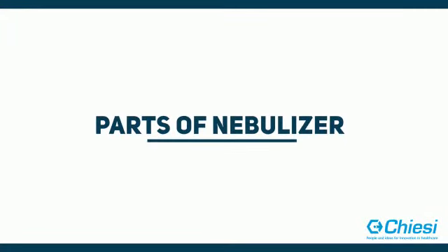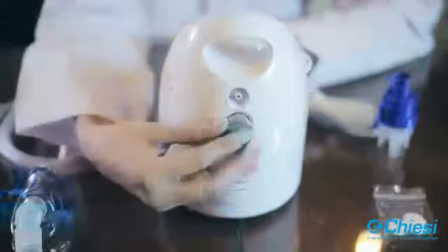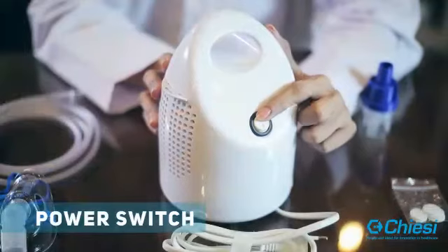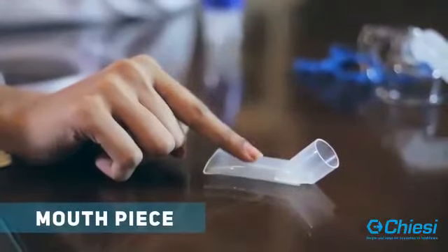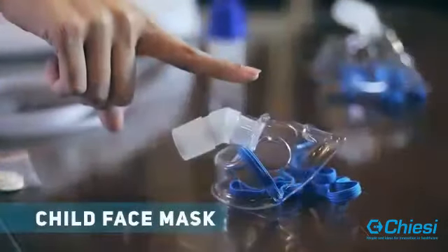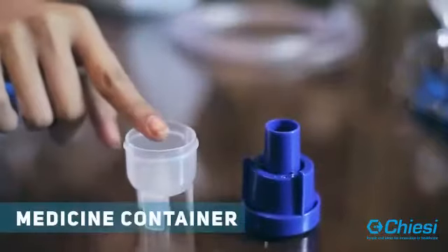Parts of nebulizer: compressor, air outlet, filter, power switch. Parts of nebulizer kit are mouthpiece, adult face mask, child face mask, medicine chamber, medicine container, cap.